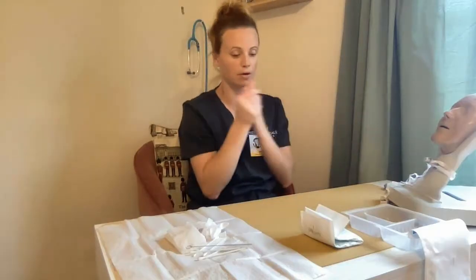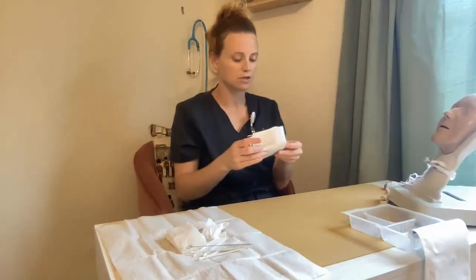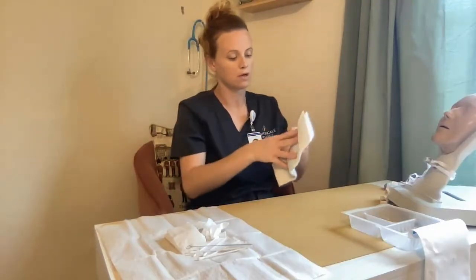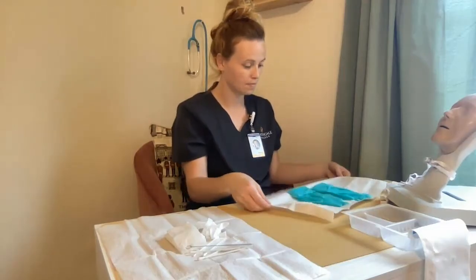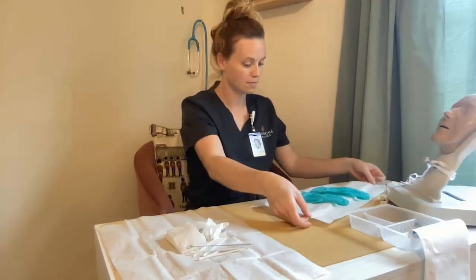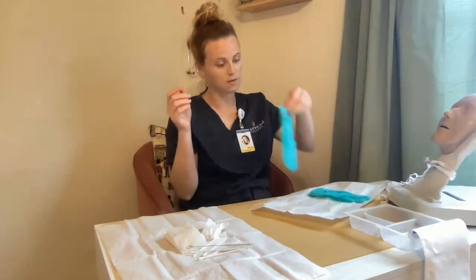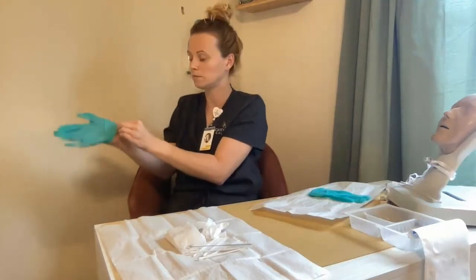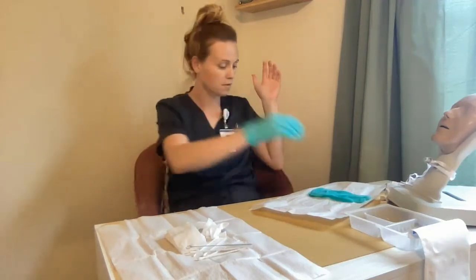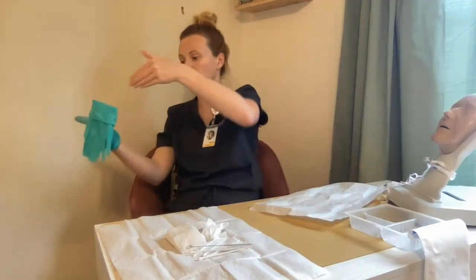Hand hygiene. Then I'm going to put on my sterile gloves — same concept applies. I want to touch the outside portion, or the one-inch border only. Non-dominant hand here, back away from the sterile field.